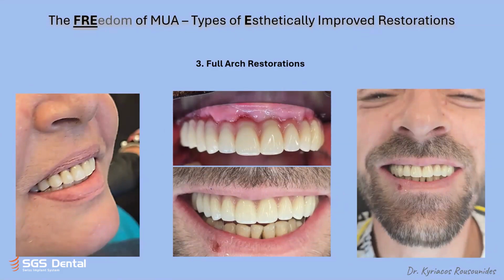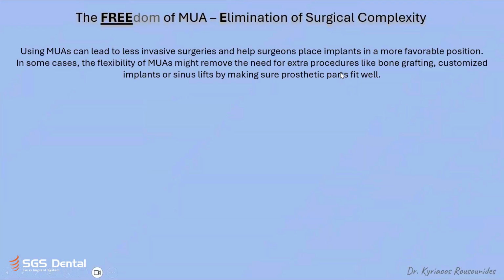I know it's a bit difficult at the beginning to find the right angle, but never mind, you can correct it later with the technician, or you can do the first impression or the first scan directly after the surgery, and you can correct it with the final. And in coordination with your technician, he will guide you to place another angulation maybe, or a lower abutment, so it cannot be seen after.